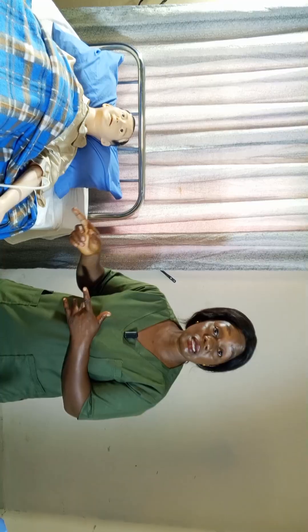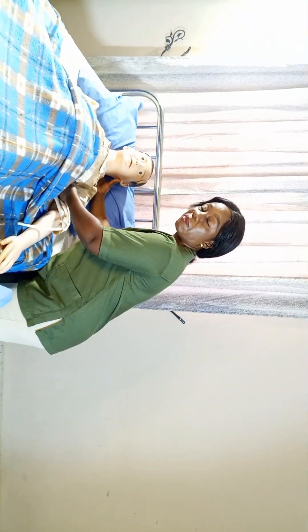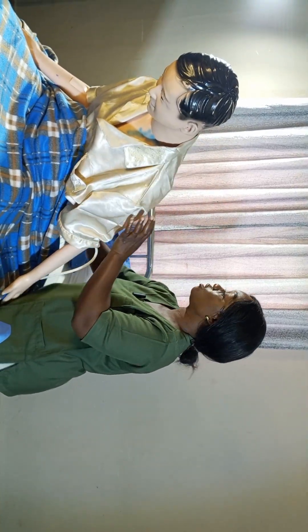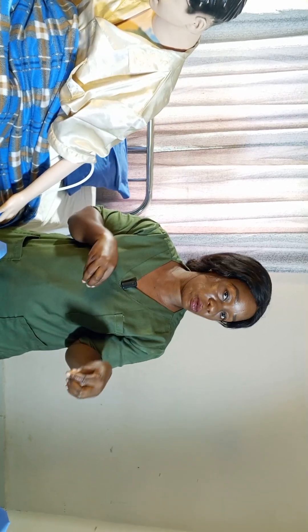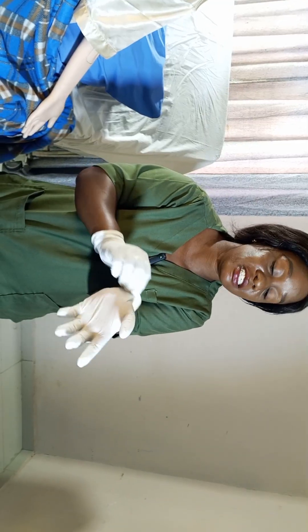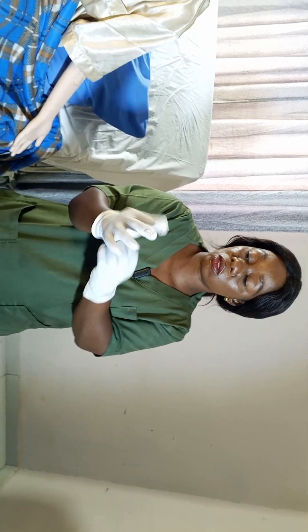The next step is to position your patient. I ask the patient, Mr. Chikwe Meka Eze, can you sit down please? I am going to perform this procedure with the patient seated. Now that I've positioned my patient, I'm going to perform hand hygiene. I'm done performing hand hygiene and I've put on my gloves to prevent cross-contamination.